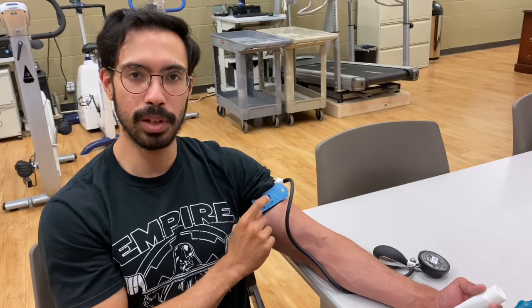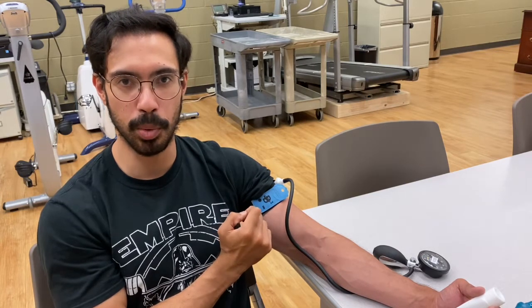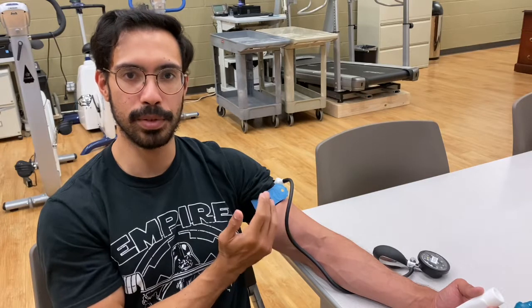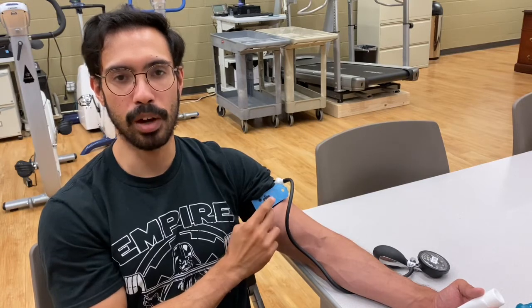So we're going to find the blood flow cutoff point, the AOP, and then we're going to dial back on that using a percentage range. So between 40 and 80%. For the lower body, you want to use a slightly higher percentage. For the upper body, a slightly lower percentage. So typically with the upper body, it's recommended that you're using somewhere around 40%.